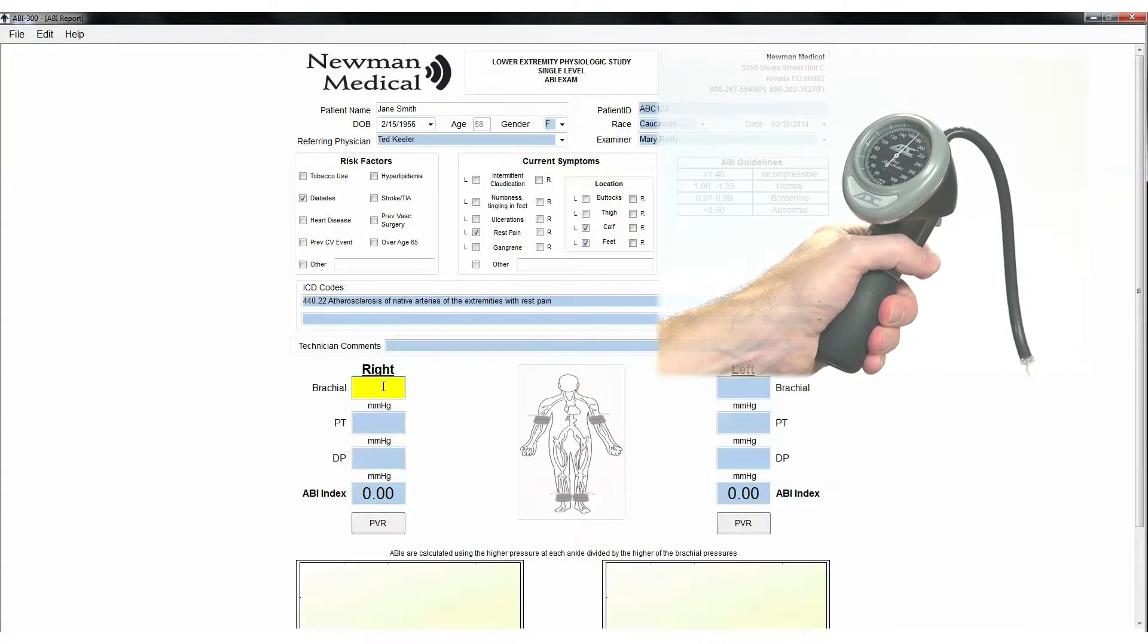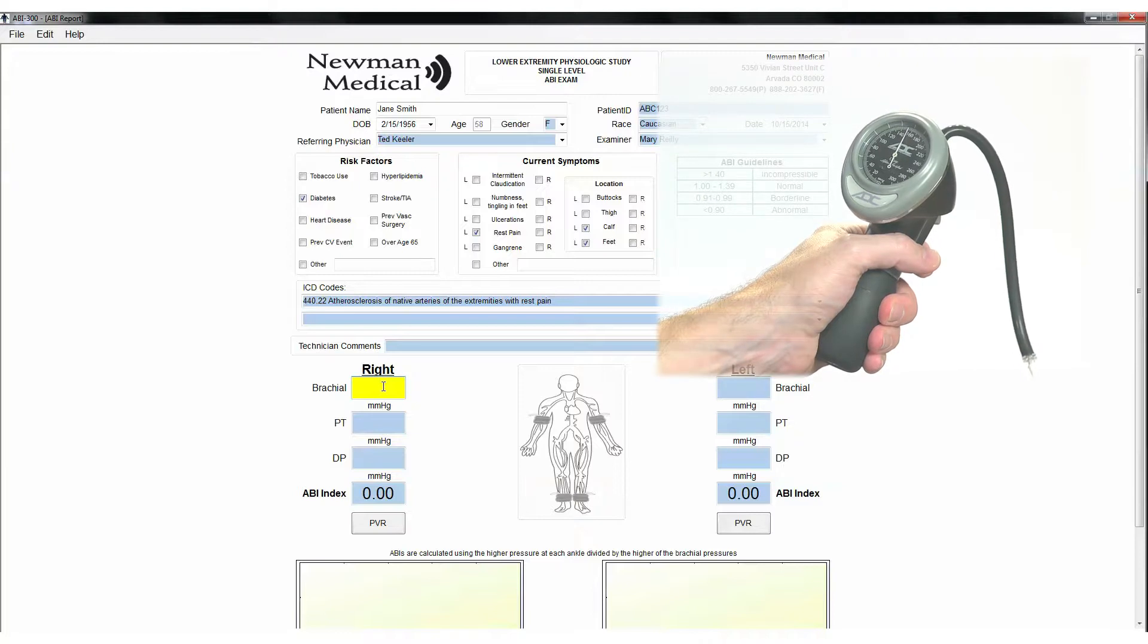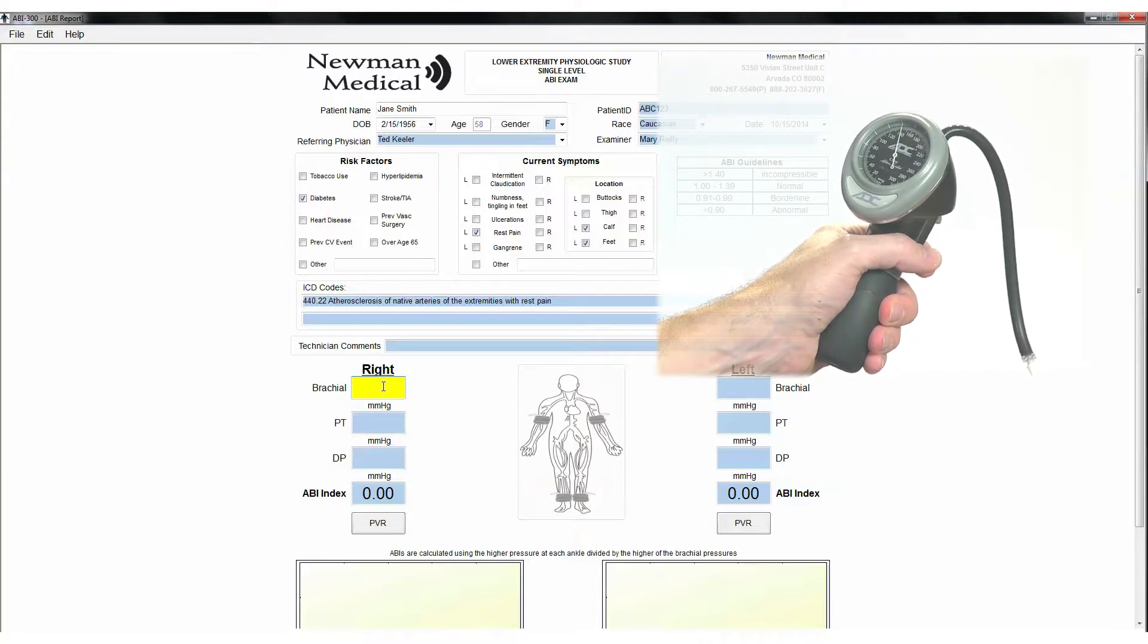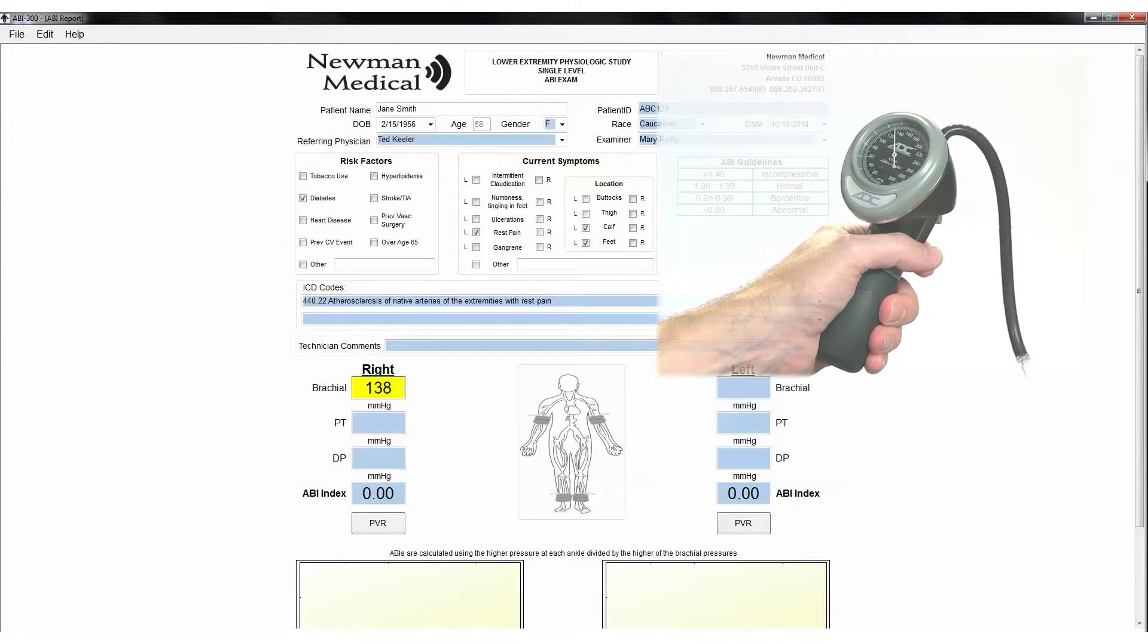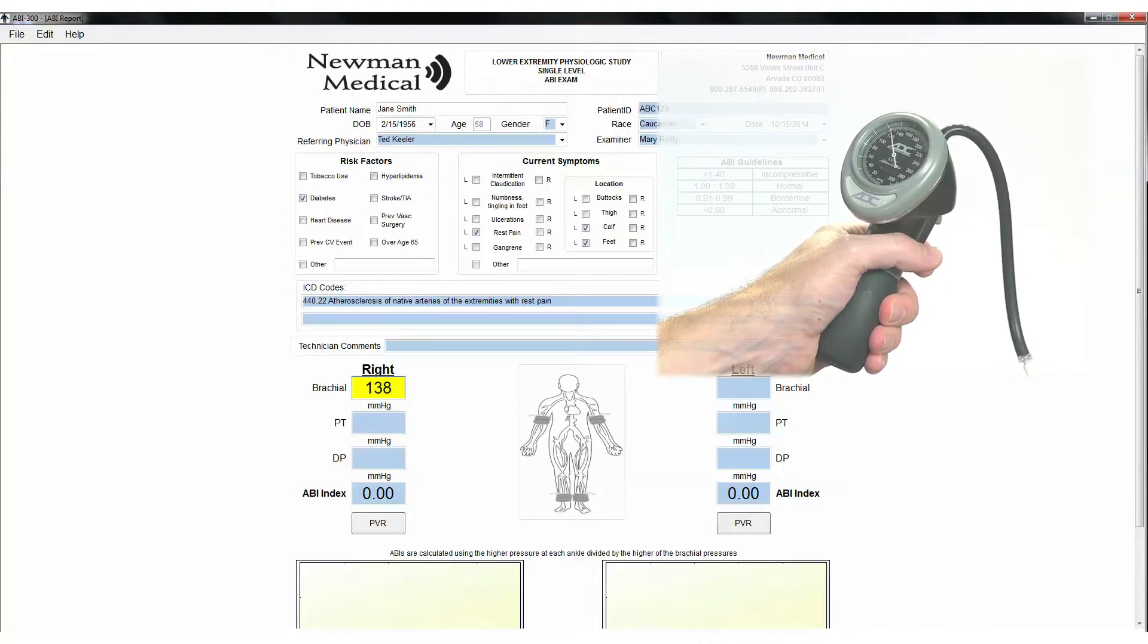With the release button, slowly deflate at approximately 2 mm per second. When you hear the Doppler signal return, note the pressure on the aneroid gauge and enter it in the right brachial field.